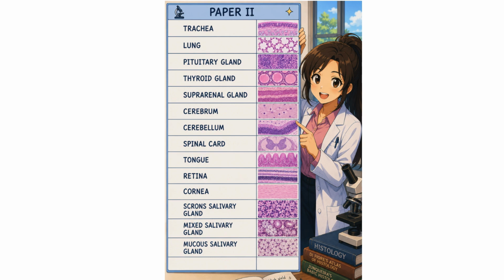And coming to salivary glands, you have serous, mucous, and mixed. Coming to serous, the example is parotid. It is purely serous. You have round, dark-staining, basophilic acini, no mucous acini, and the nucleus is round and in the center. You have prominent striated ducts, whereas in pancreas you don't have striated ducts.